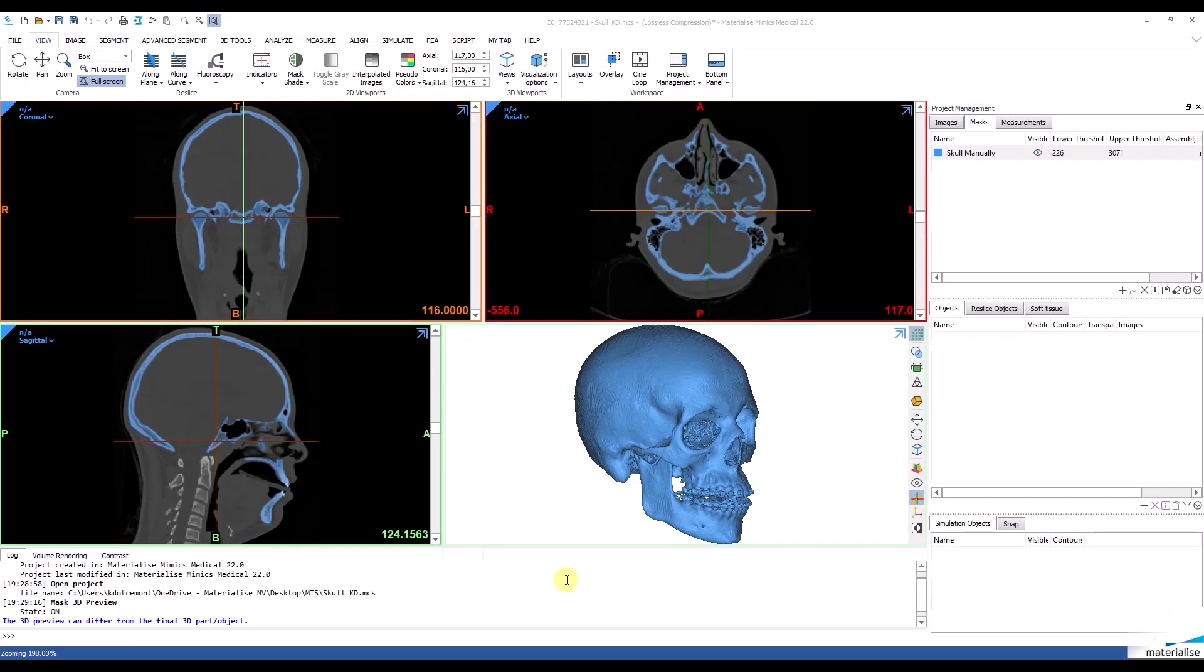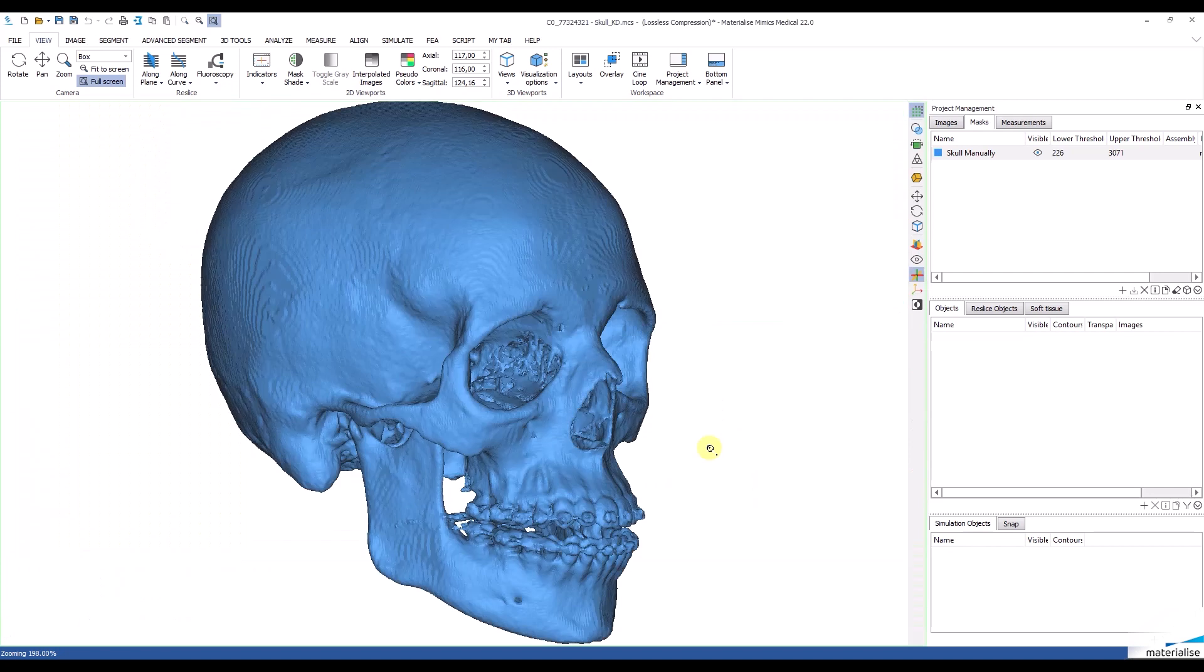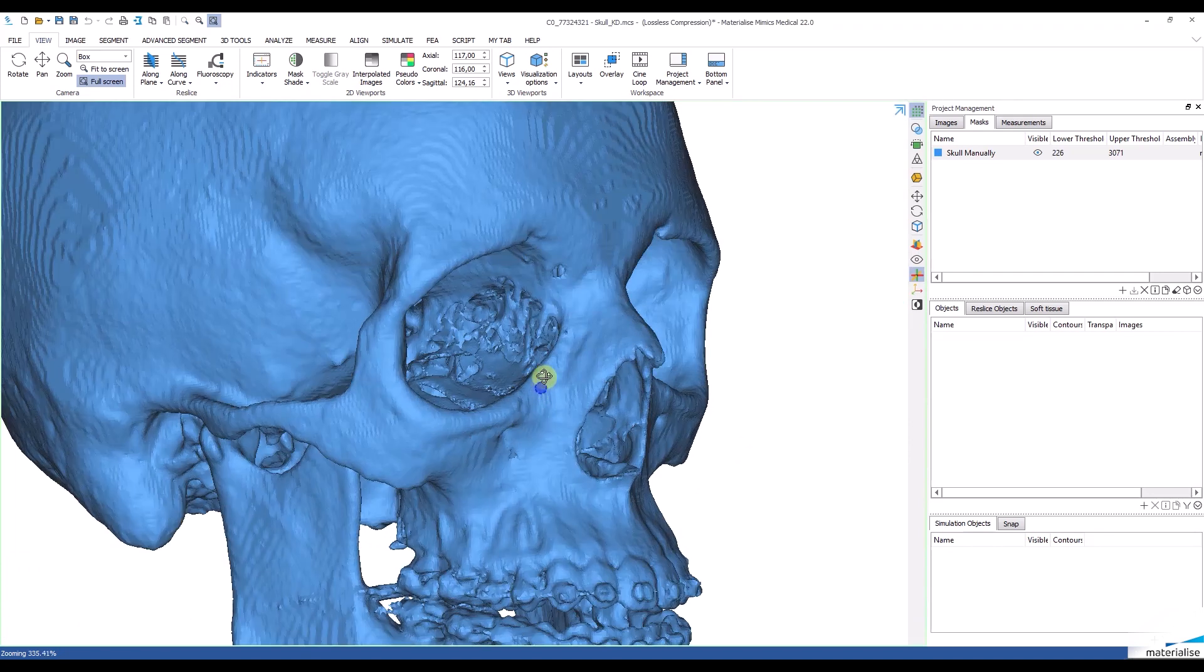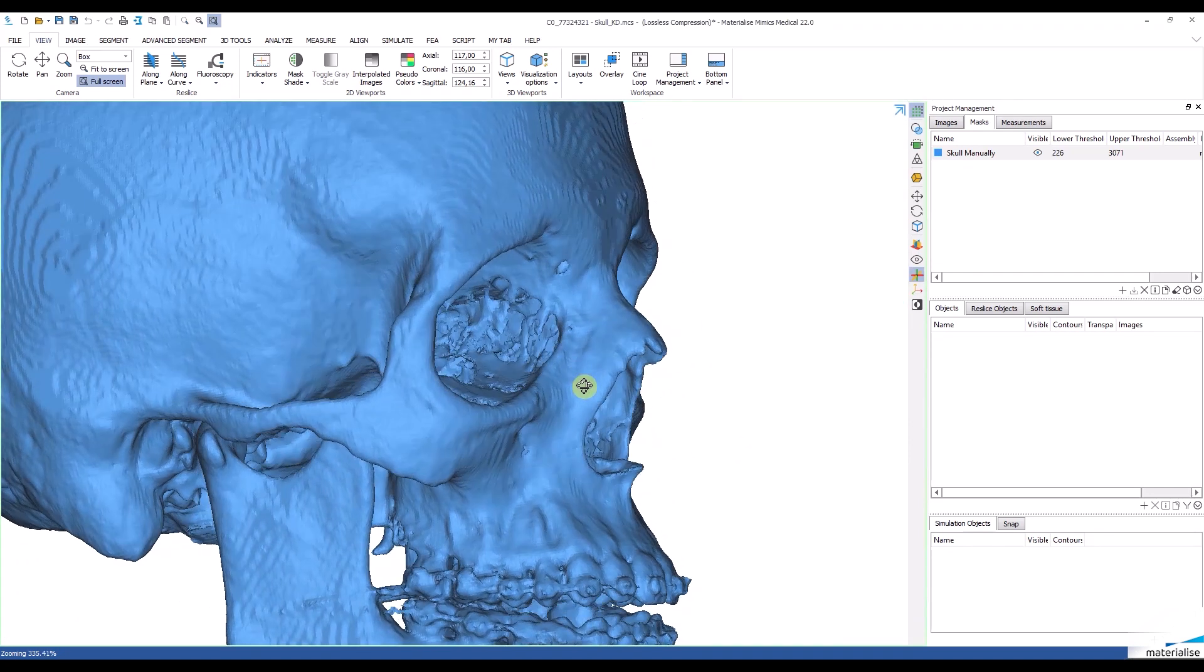I will start in Mimix and as you can see, the dataset is already loaded into the program. I segmented the skull just moments ago and if I zoom in, you will be able to see that the orbital floor is not completely closed.